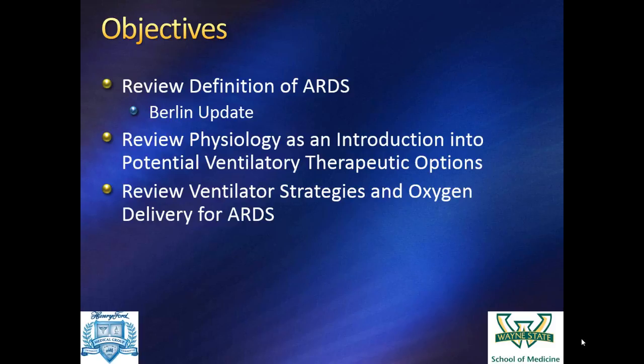A couple of things that are interesting apropos to your comments are that it's not all about oxygenation. When you look at the ARDSNet trial, at the high versus low PEEP and at low tidal volume versus higher tidal volume ventilation, the group that got low tidal volume ventilation had reduced mortality, which is why we do it. They actually have worse oxygenation in the first day or so. So it's not all about oxygenation. Nitric oxide studies haven't shown that. The thing that you brought up is important, but I think it's worth mentioning that when you apply PEEP or airway pressures on a ventilator, you don't know how much of that is being transmitted to the vascular space because of changes in lung compliance.